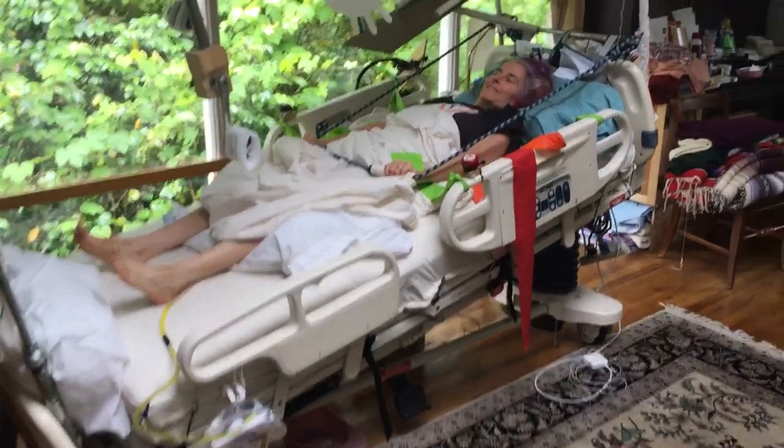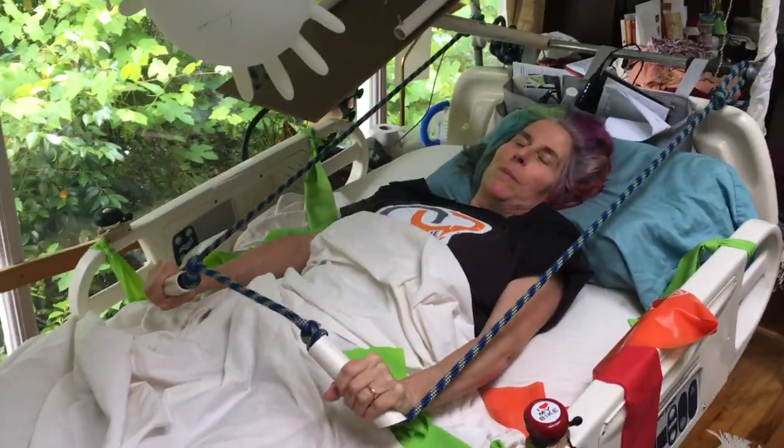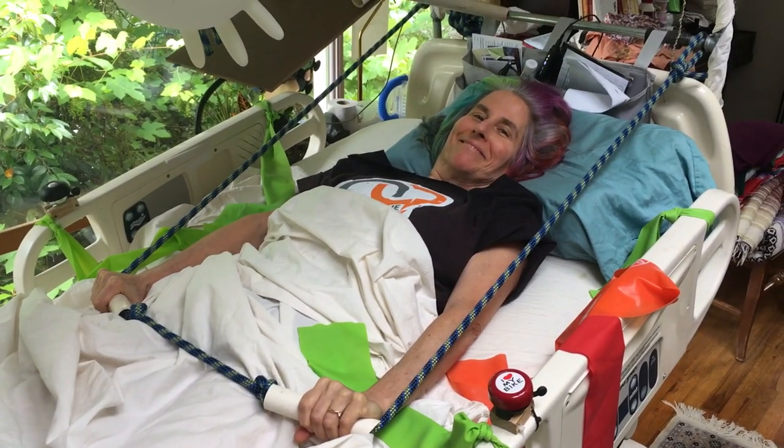This is also a good preparation for using a walker, which will be my next step in being vertical. Thanks a lot for modeling, Lori.